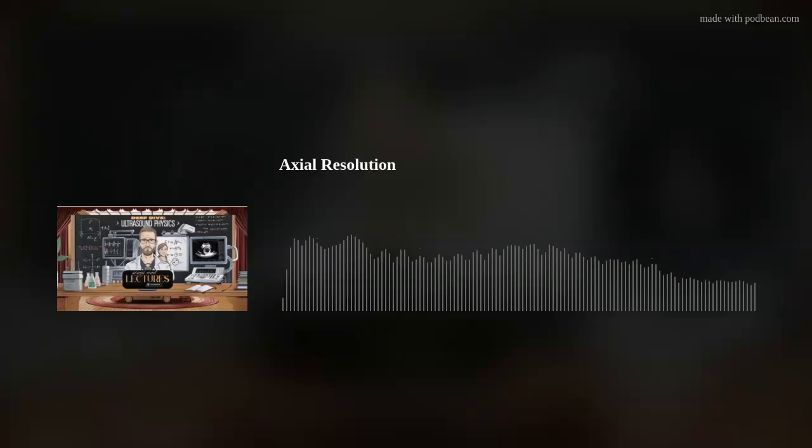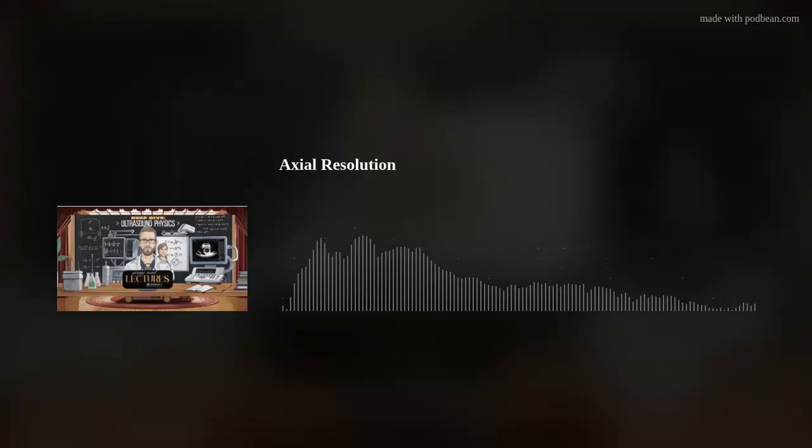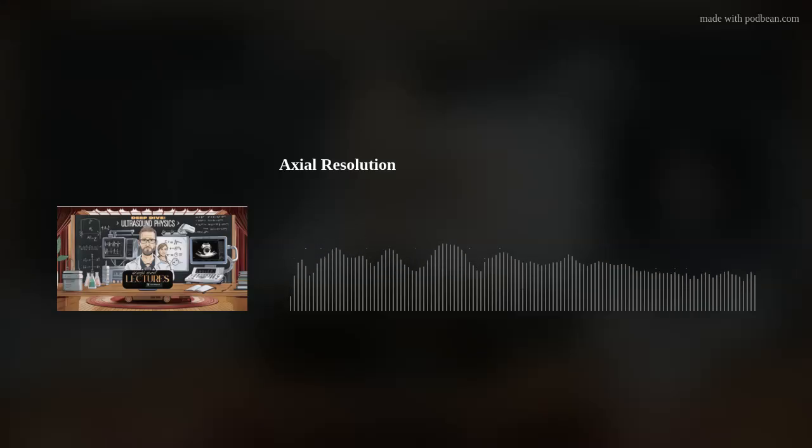That's actually genius. What about the wavelength part? So, higher frequency waves have shorter wavelengths. And since pulse length is cycles times wavelength, shorter wavelengths give you shorter pulses. Okay, so how do you get higher frequencies, though? This is cool. Thinner crystals vibrate faster. It's like guitar strings? Thinner strings make higher pitches.